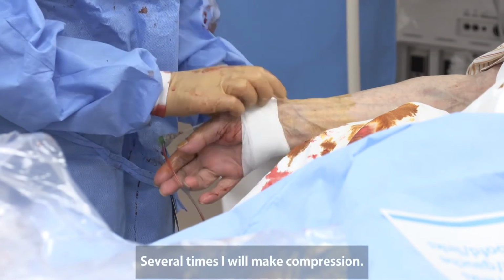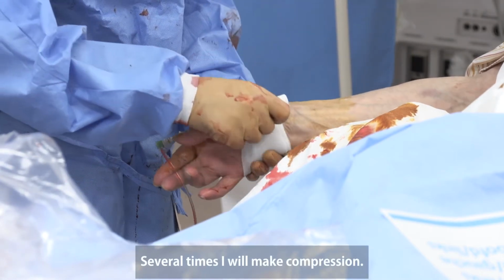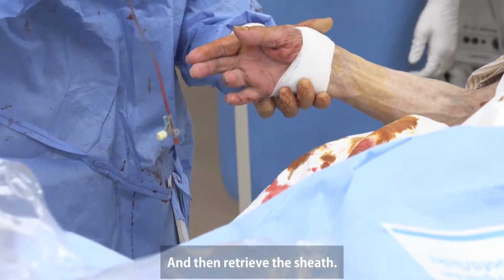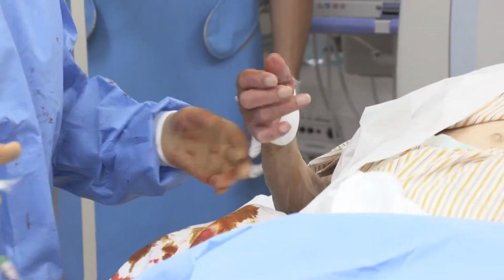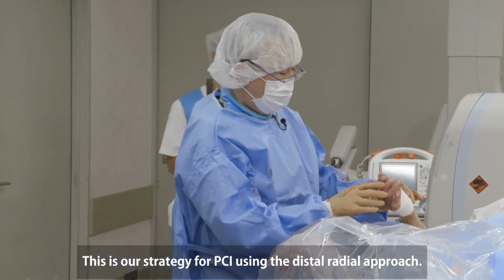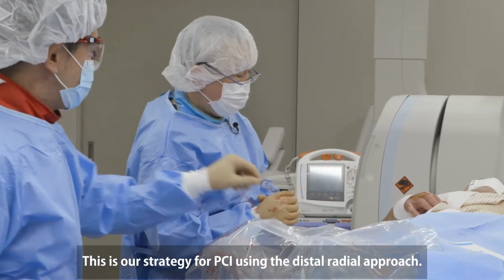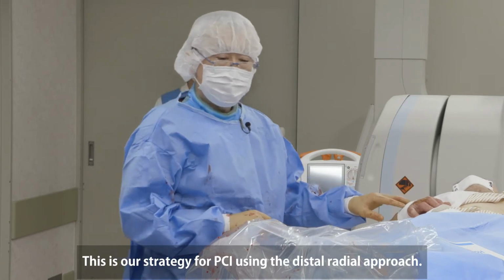Several times I will make a compression, and then we retrieve the sheath, and then finished. Thank you very much. This is our strategy for the PCI using the distal radial approach.